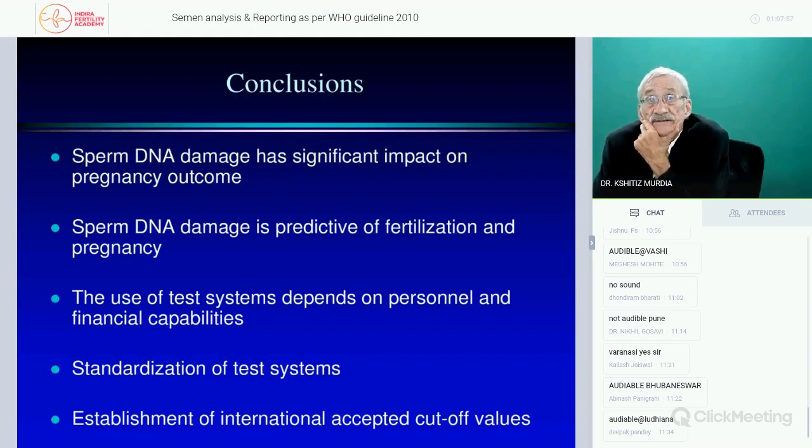The use of test systems depends on the personal and financial capability. Some of these DNA tests are very expensive and very time consuming. It takes a technician the whole day to do, for instance, a TUNEL assay. And the standardization of the test is lacking.